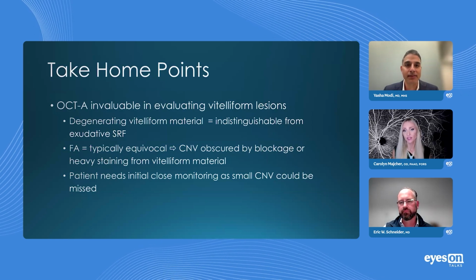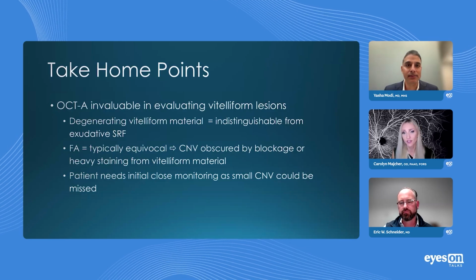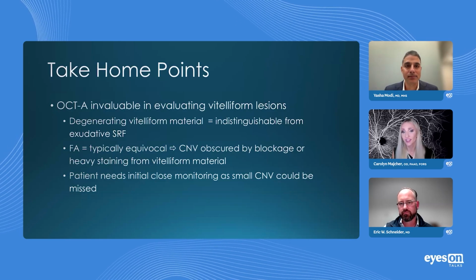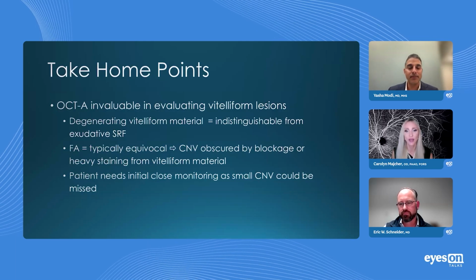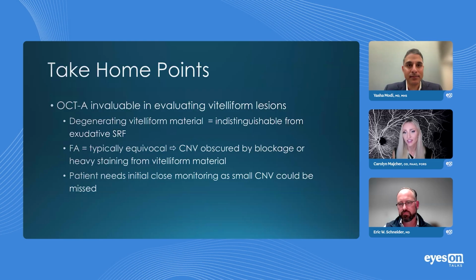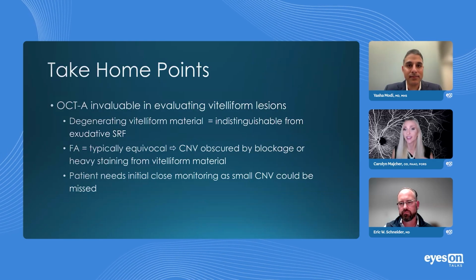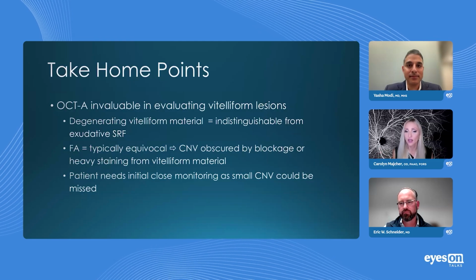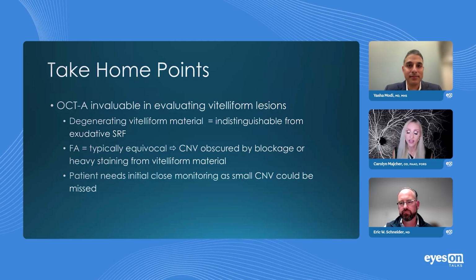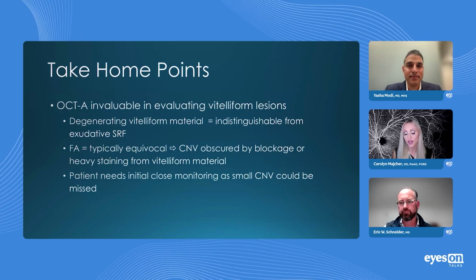Yeah, I think a lot of optometrists don't have access to FA, and so fundus autofluorescence or FAF imaging is a great alternative. I love doing it in any sort of outer retinal disease like macular degeneration, pachychoroid spectrum disease, and to detect angioid streaks. It's really valuable not only to highlight and better visualize the streaks themselves that radiate from the optic nerve head, but to sometimes also identify superficial drusen that's commonly present in patients with angioid streaks as well.